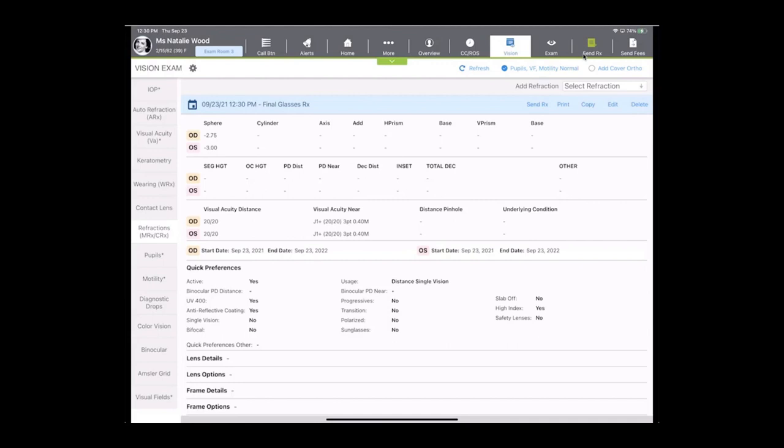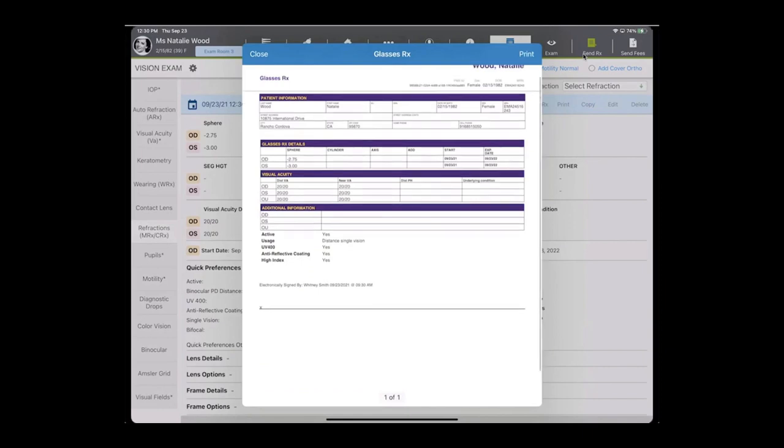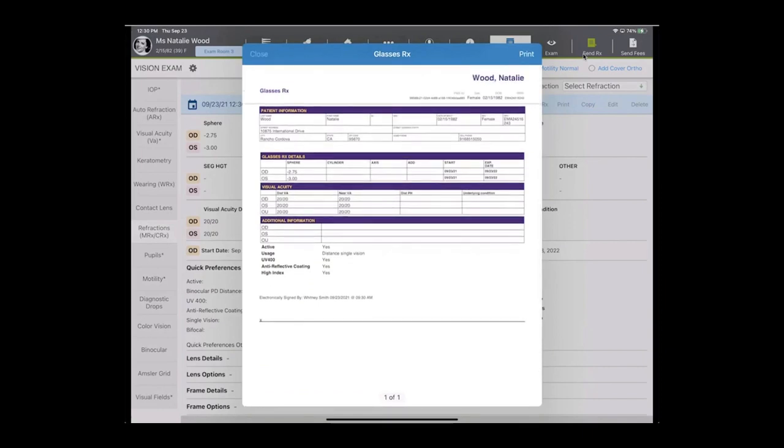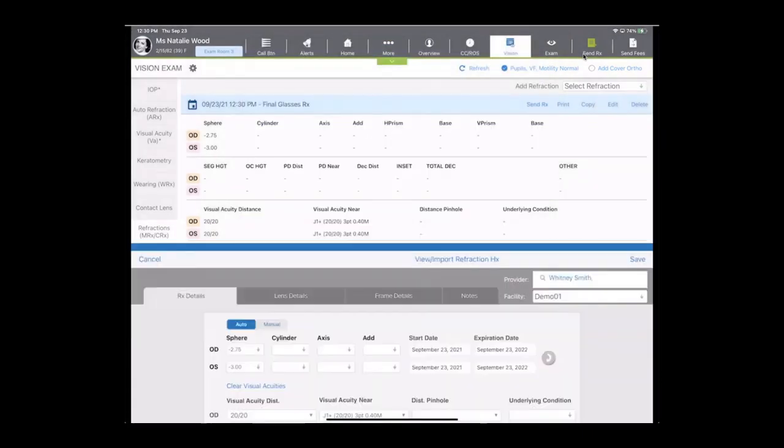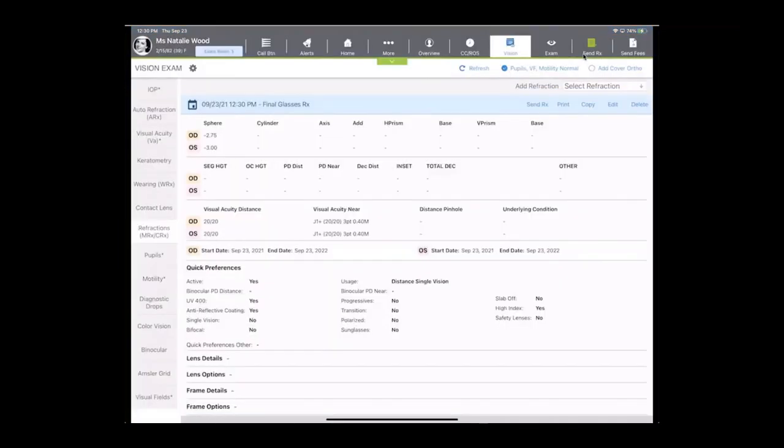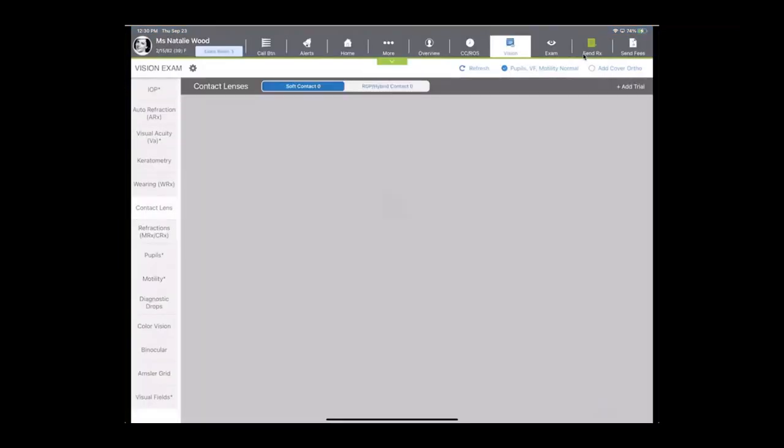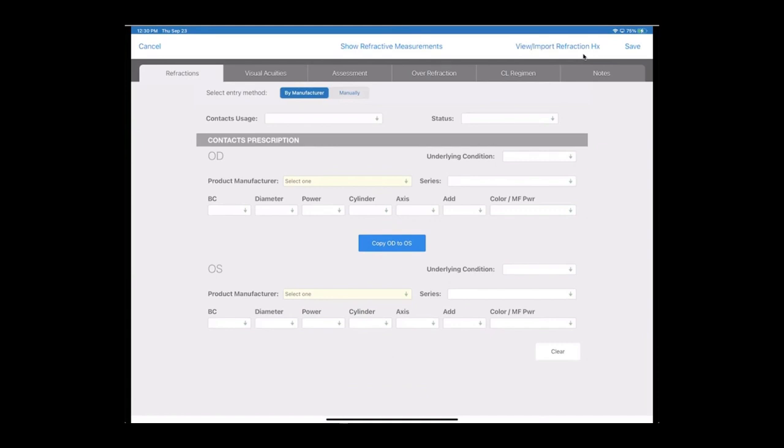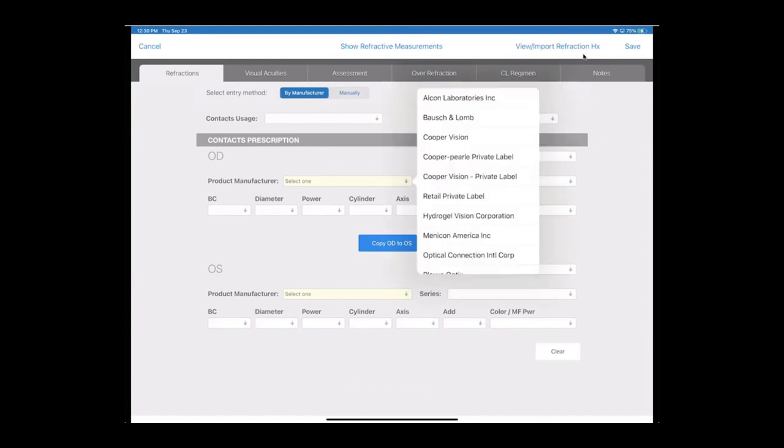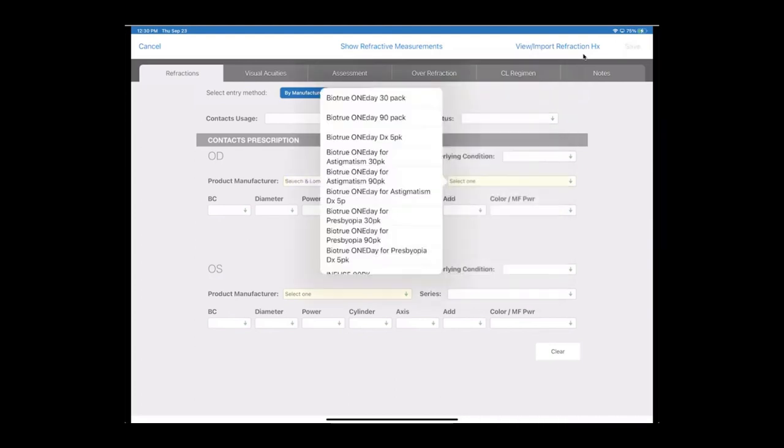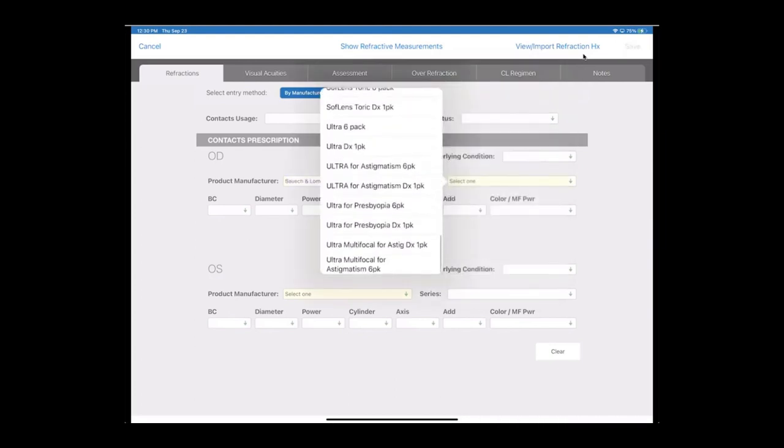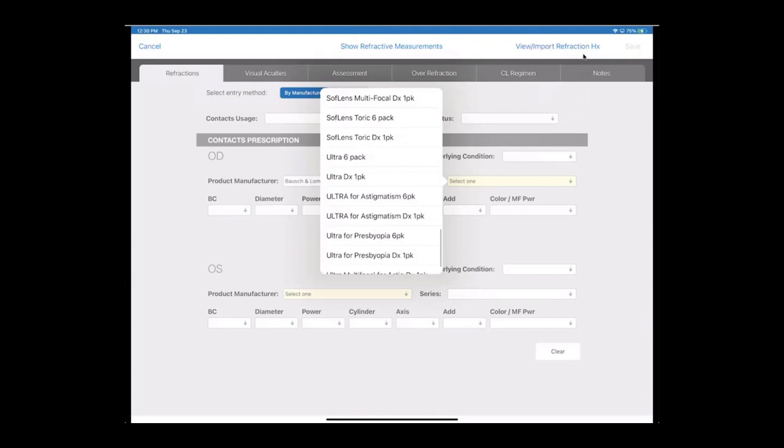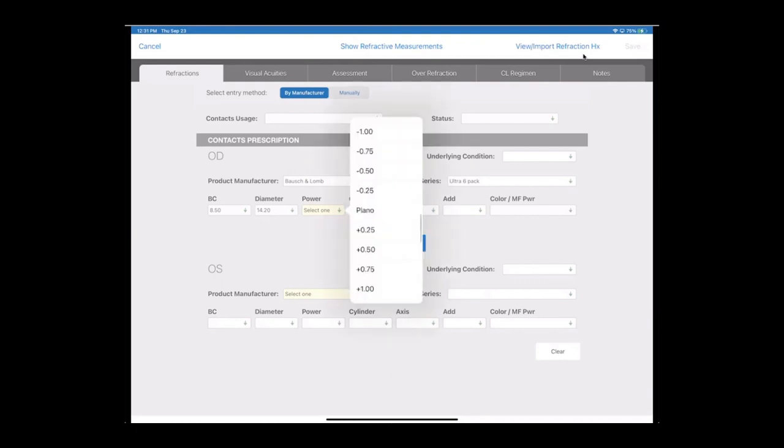We can go ahead and print this right from the iPad using our air printer, or we can copy forward and create multiple final RXs on top of each other for different usages. Real similar concept with our contact lens prescriptions, but I do want to note that if you're interested, you can completely prescribe by manufacturer. So maybe I want to prescribe an Ultra six pack for this patient. Only the available power ranges in this modality will populate for us.